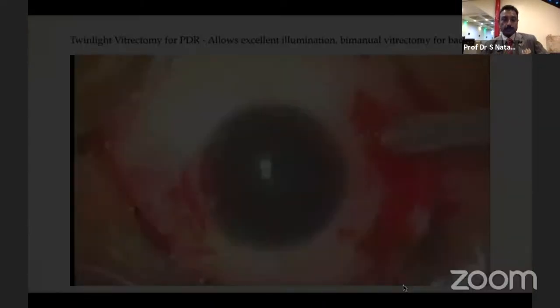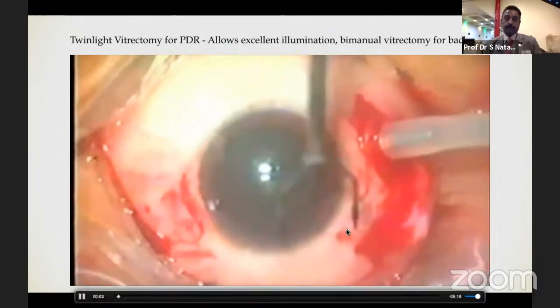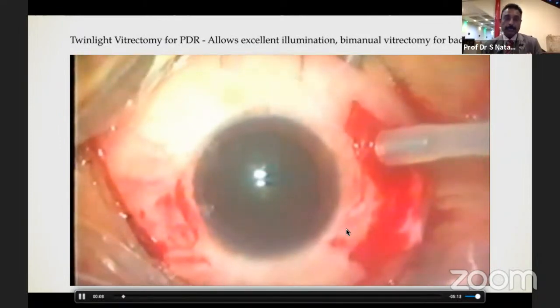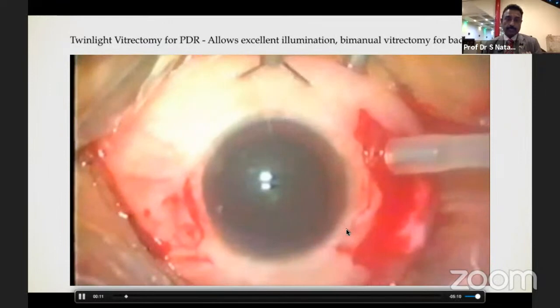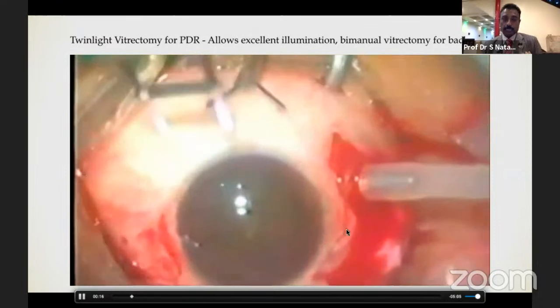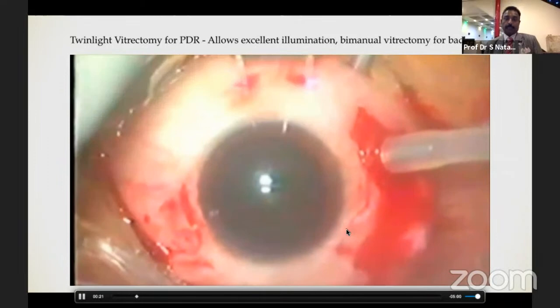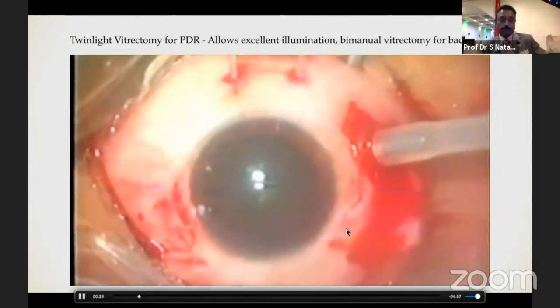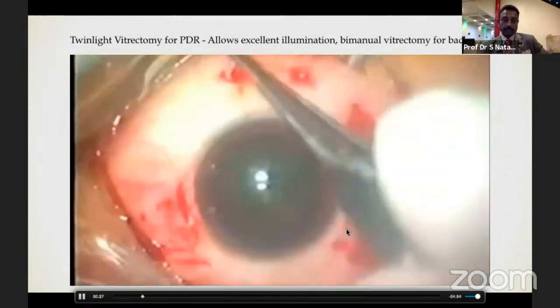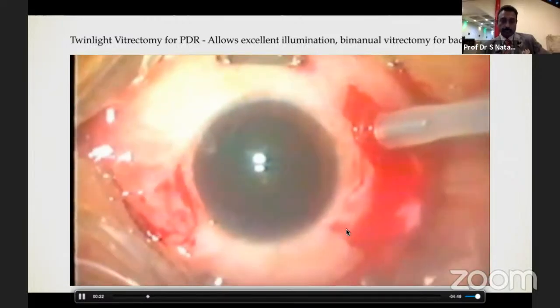Here, this is an old video I did, archived, and I'm using the twin light, which is a twin light introducer by Klaus Eckhart, made by Dorc at that time. You make an incision, and this has excellent endo illumination, a chandelier illumination. Because of this twin light, it is stable, doesn't move, and usually you will not see much shadow. The only thing is to introduce this twin light with the stiletto you are using. But if you put things wrongly, you will not be able to see.